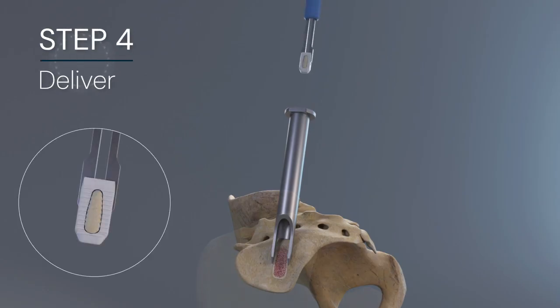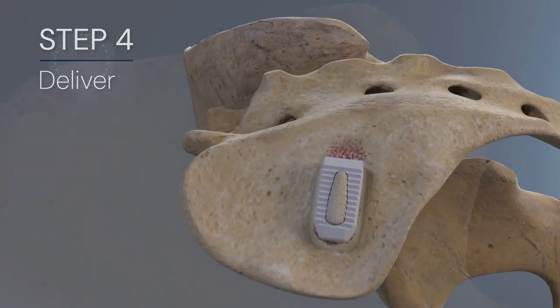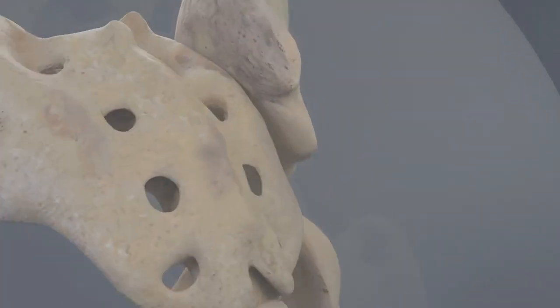Finally, the implant window is packed with bone graft and delivered under compression to stabilize the joint and provide conditions for long-term fusion.